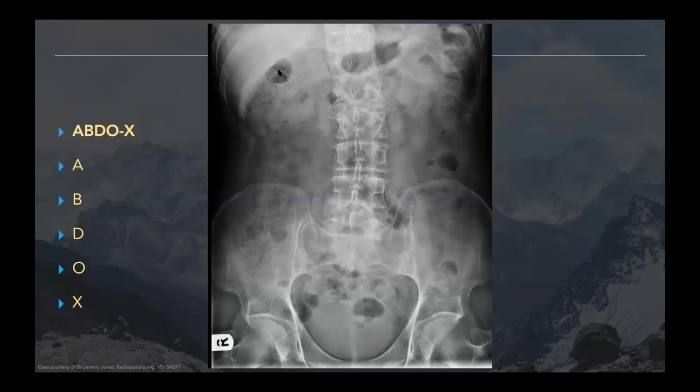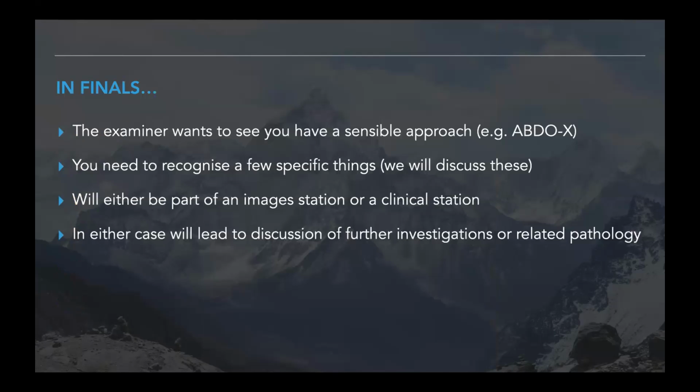So something like that. What the examiner wants essentially is to know that you have a sensible approach and that you can work through an abdominal radiograph. Because the applications are so limited, you only need to know a few specific things, and we'll discuss those here.